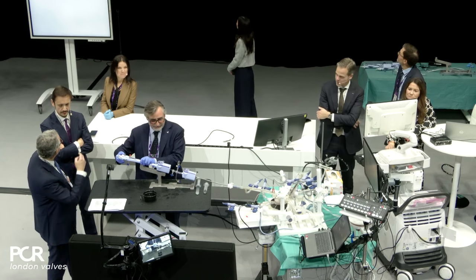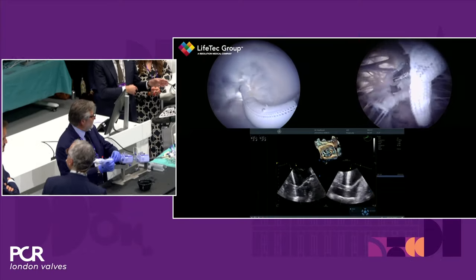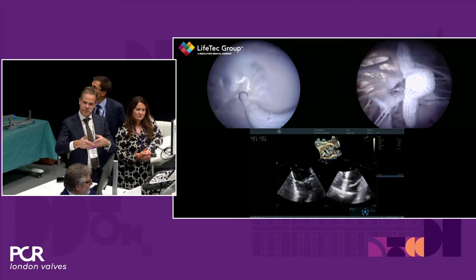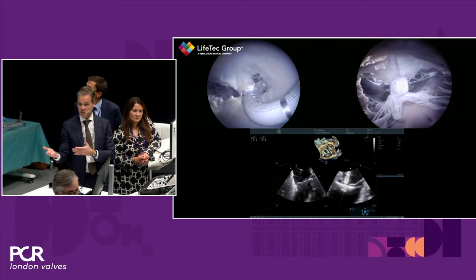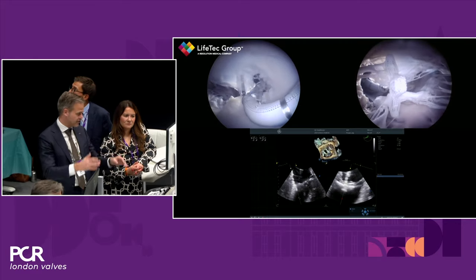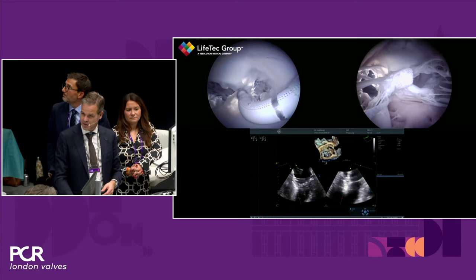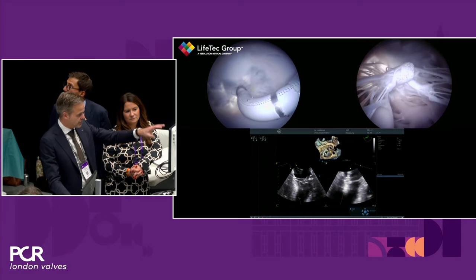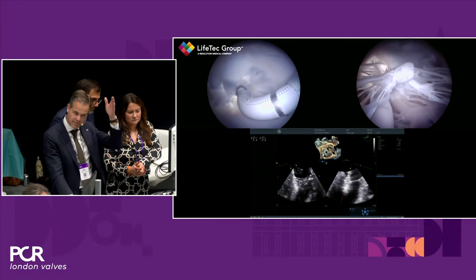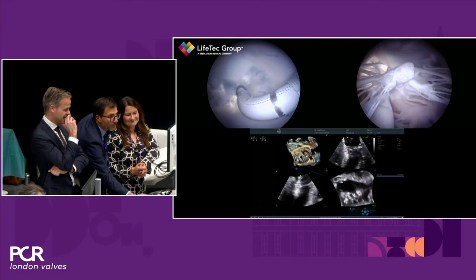Yeah. Maybe you can check it also with the MPR. Yeah, maybe good to show it indeed, because we saw with the X-plane that we couldn't be completely aligned with the catheter, and I think that's where the nice benefit is. We learned it actually more from the tricuspid field, and we're using the MPR on the mitral field as well. But now we can nicely align all the catheters and have an even better grasping view on the right side than we had before. And the nice thing also, normally you can have a short axis at the same time, so you can check your perpendicularity at the same time as your path. So thank you. Great.